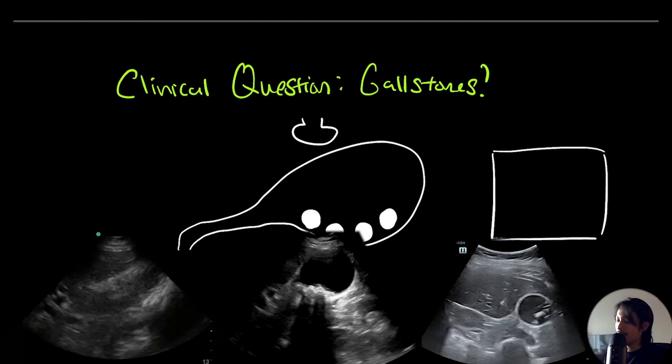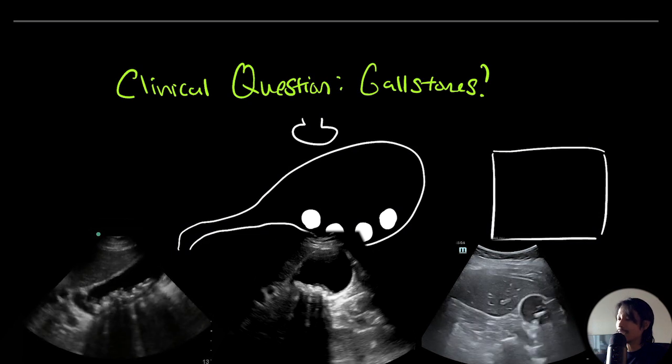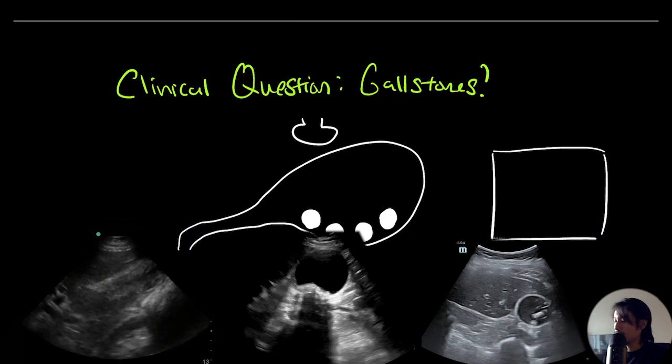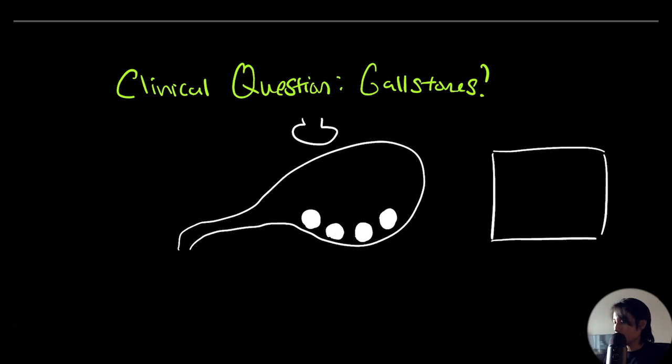And I just want to point out, these stones have a very interesting artifact on ultrasound, which is called shadowing. And so you can imagine if this is the ultrasound beam, it's looking at things, sending a wave out. What is this? Oh, this is the little gallbladder wall. Let's put it on our screen. What's this? That's the other end of the gallbladder wall. Put it on the screen. And it comes down to these stones.